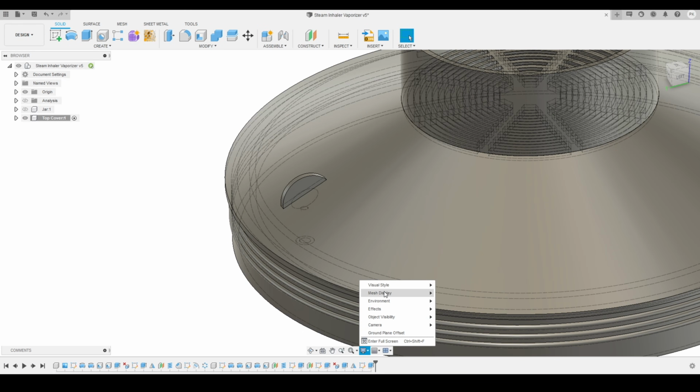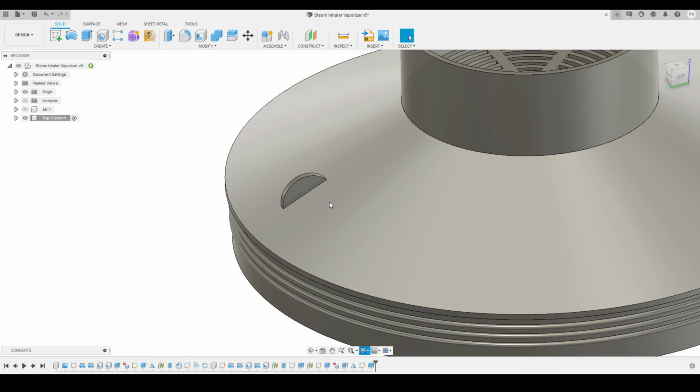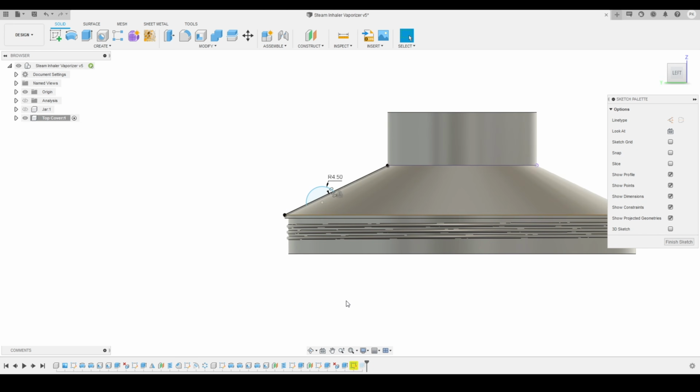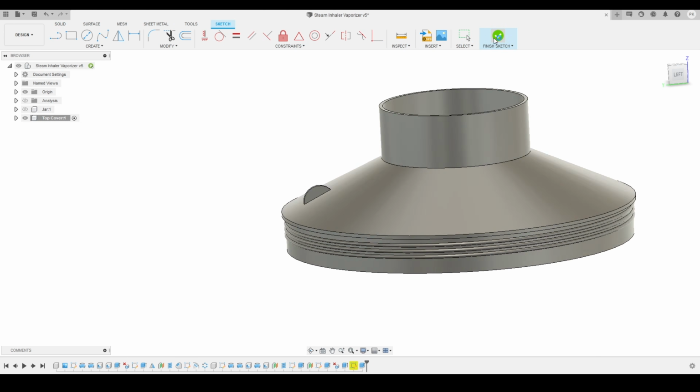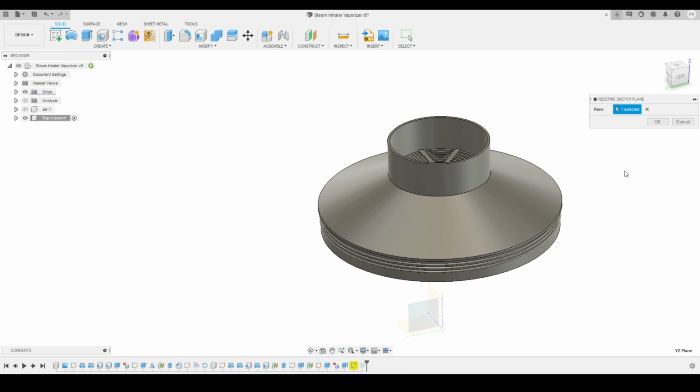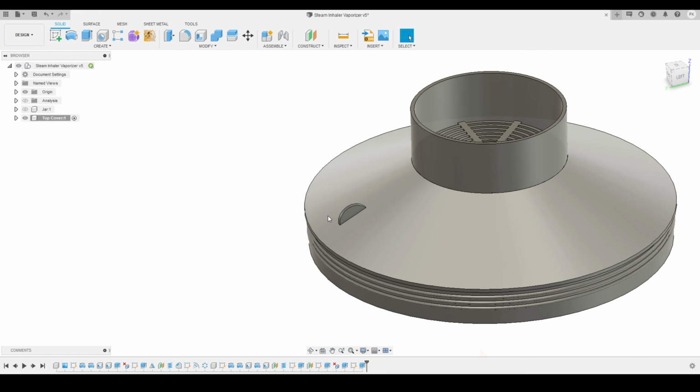So before moving forward, I will change the visual style back to the shaded with only visible edges. Now we'll delete this mirror that we had created earlier, and we'll edit this sketch to make sure that the errors are gone. So we have to redefine the sketch plane. I just redefine the sketch plane and press OK. Here you can see now the errors are gone.